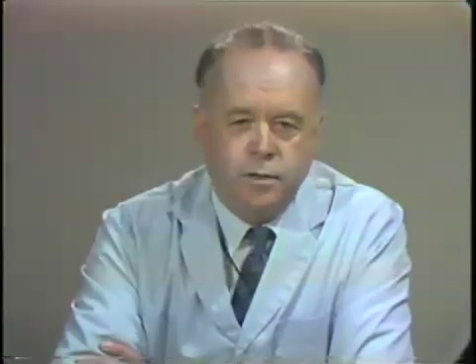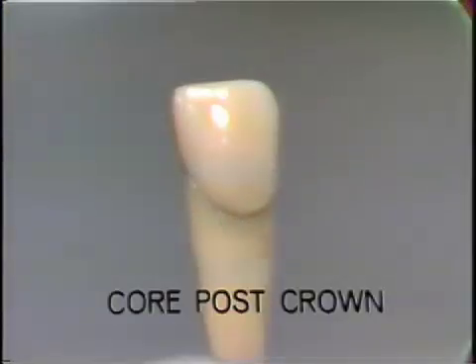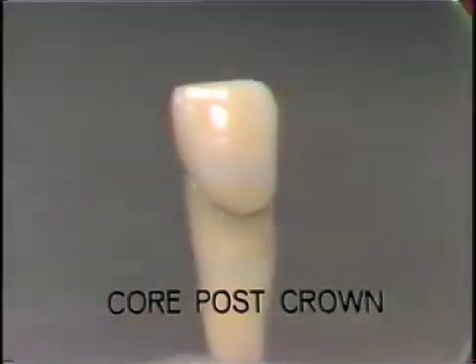The core post crown is used as a bridge retainer on non-vital teeth in which the crown, for some reason, is no longer savable. The core post crown can be used on any of the maxillary or mandibular teeth, and the core of the preparation can be covered with any type of complete crown, either a veneer crown where aesthetics are important, or with a complete gold cast crown in posterior regions where aesthetics is not quite so critical. The example which I have on the bench here is of a core post crown on a maxillary central incisor.